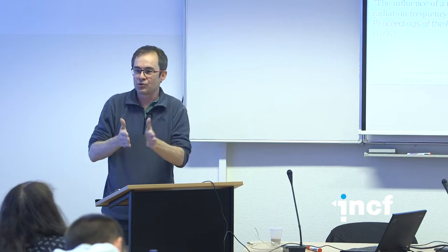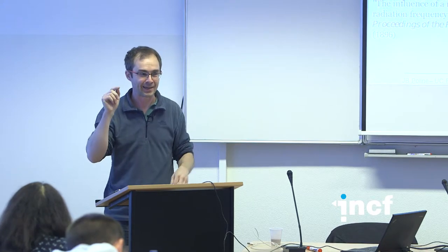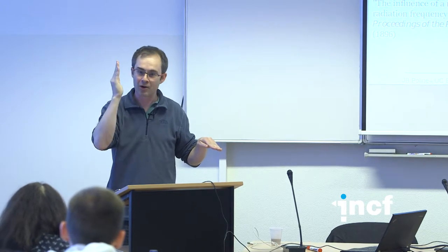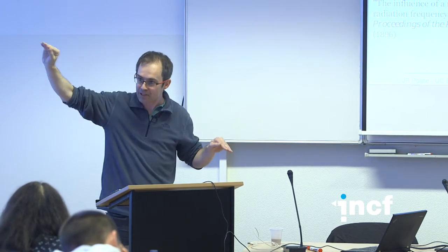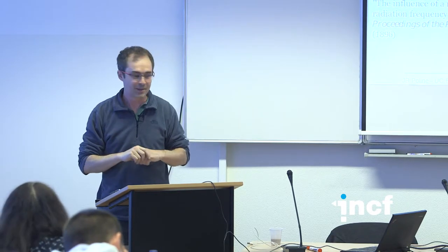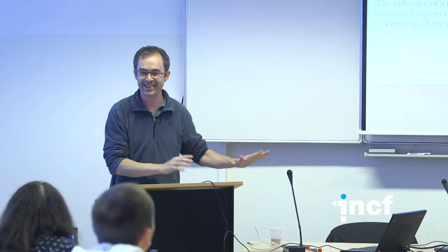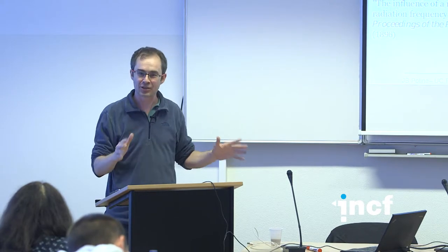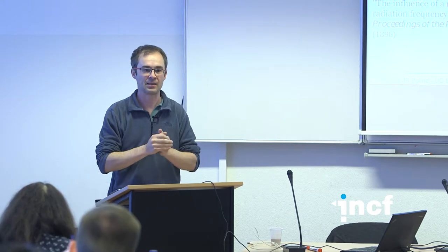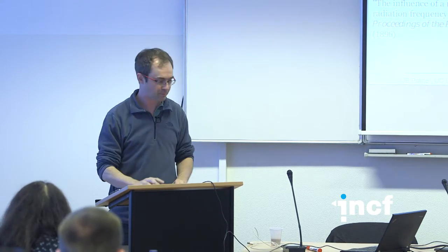And then the other thing is, how do you know the z direction? Well, in the z direction, you can actually do the same trick, but at the excitation level. If you have a gradient in the z direction, you're going to excite only one specific frequency depending on the z position, because the magnetic field changes the frequencies. So just to summarize this, I'm taking too much time for that because I find it fascinating, but the way you localize things is by varying the gradients of the magnetic field with space.